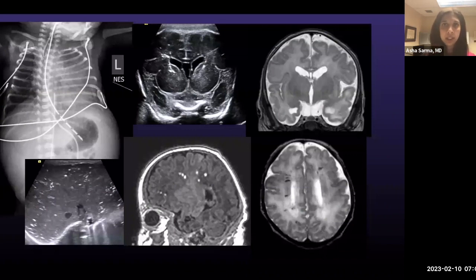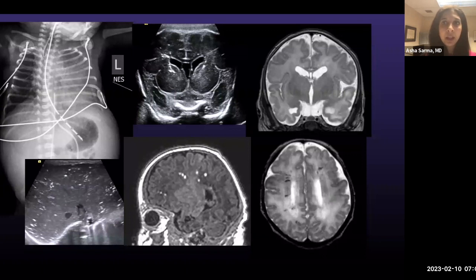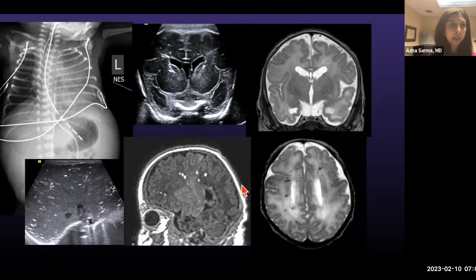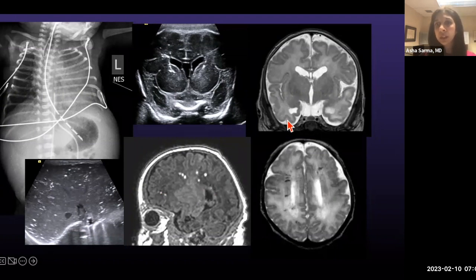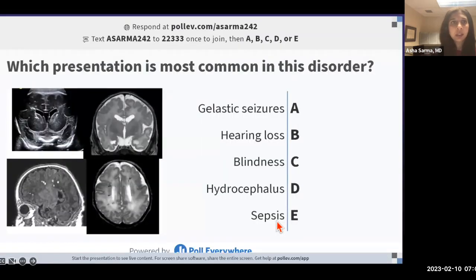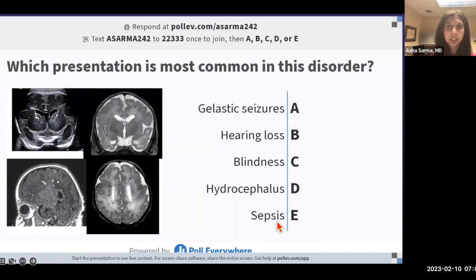I'm going to show you images from a case and then move to a poll question. We have a plain film showing the liver, an ultrasound, a T1-weighted brain MRI, coronal head ultrasound, coronal T2-weighted MRI, and axial T2-weighted MRI. The question: which presentation is most common in this disorder? Options: A, gelastic seizures; B, hearing loss; C, blindness; D, hydrocephalus; or E, sepsis.